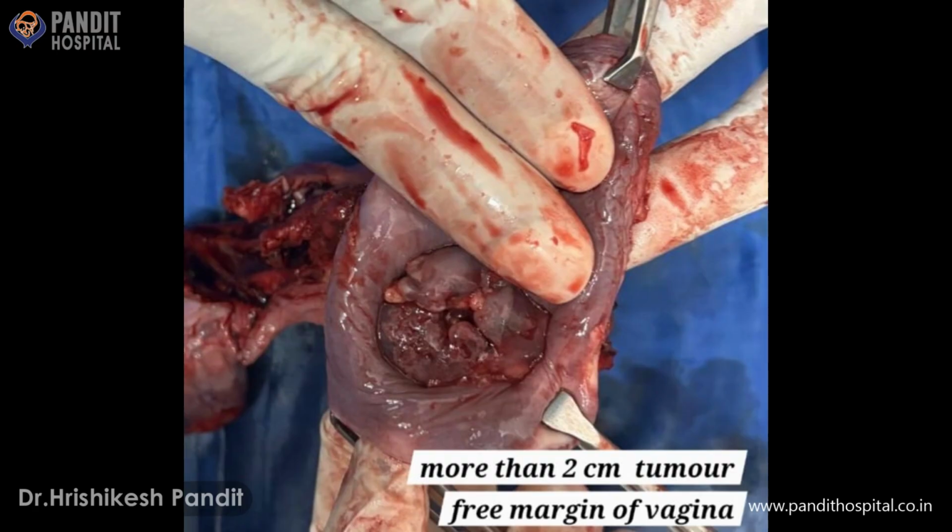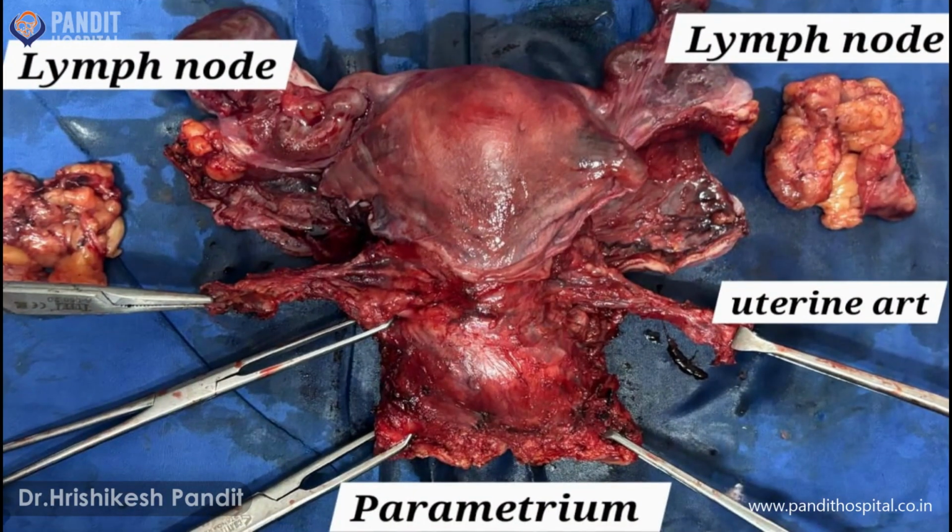Here we can see the final specimen with more than 2 cm tumor-free margin of vagina. The specimen with adequate parametrial dissection. Uterine arteries taken at origin.